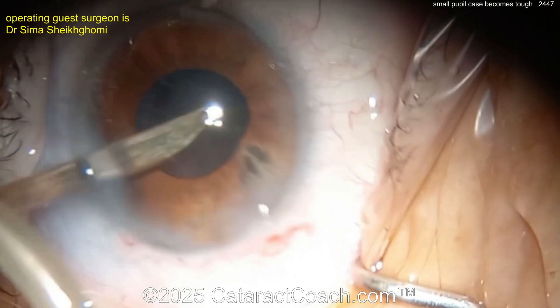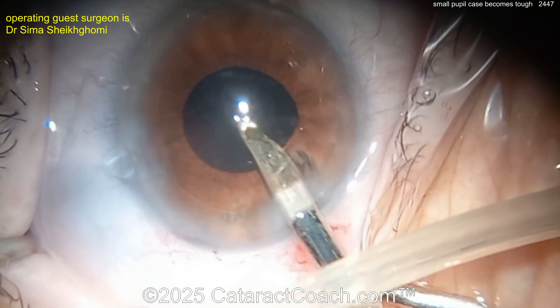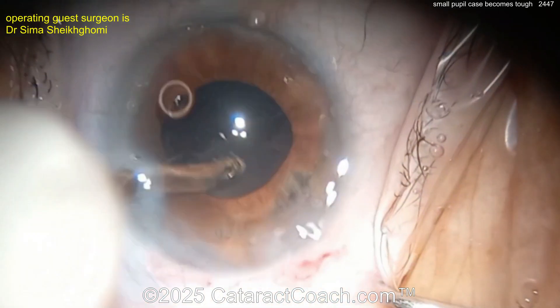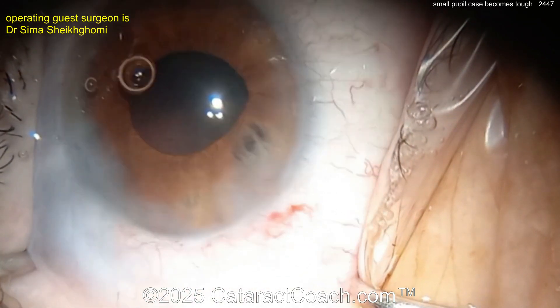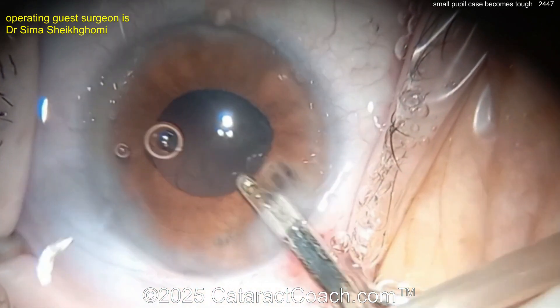You could also suture that iris defect now, for sure. But my encouragement is: use a smaller incision next time for the paracentesis. You may want to consider bimanual IA through a tiny paracentesis — you'll have an easier time — or keep your paracentesis small and use the Simcoe through the main incision. Really upgrade to a bimanual IA setup and smaller paracentesis.